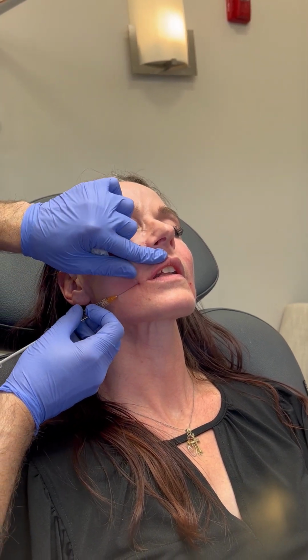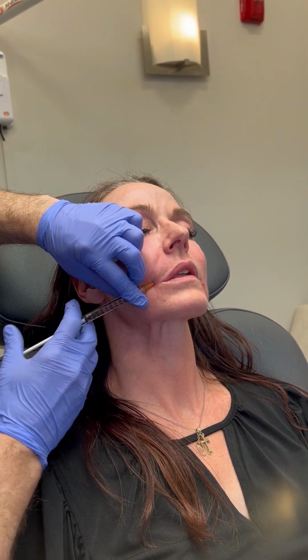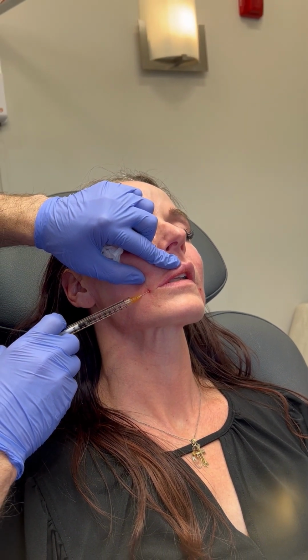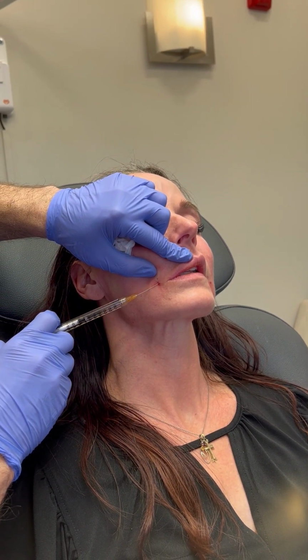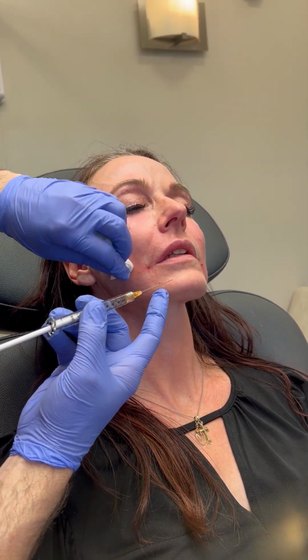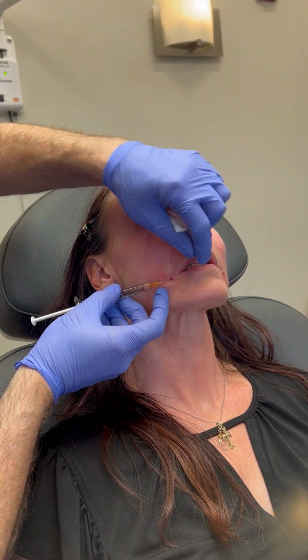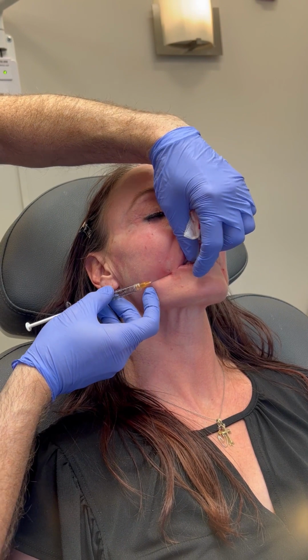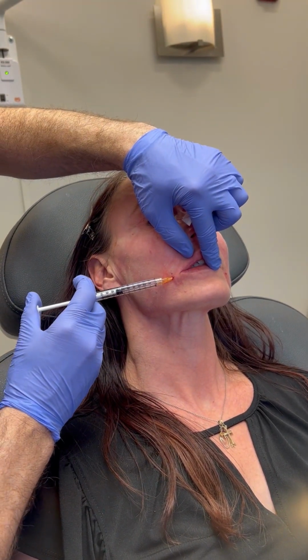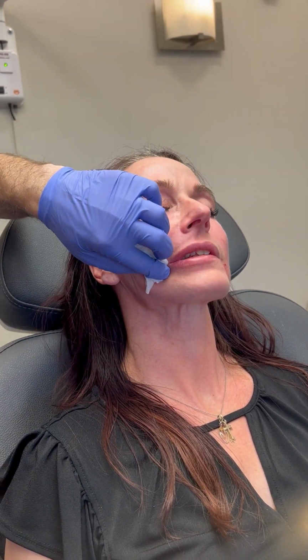The key with this is to use your left hand to guide the cannula by straightening the lip. And then again, we're just going to go lightly here. That was a quarter of this syringe, which again is really a half a syringe because it's half saline. Using that left hand to guide the cannula is key here. I'll do some on the other side.